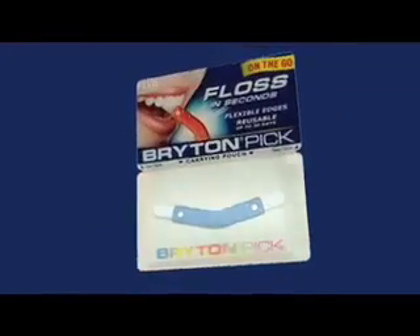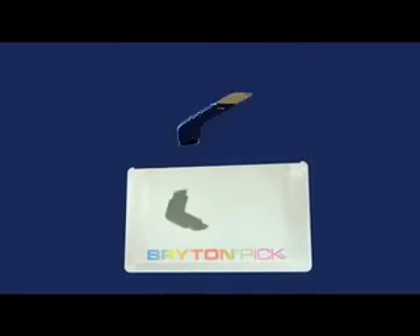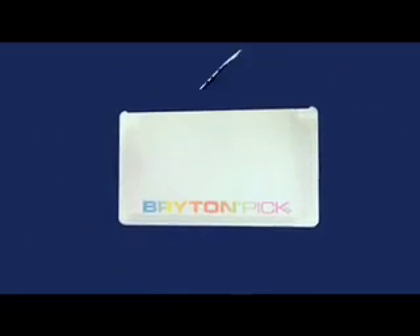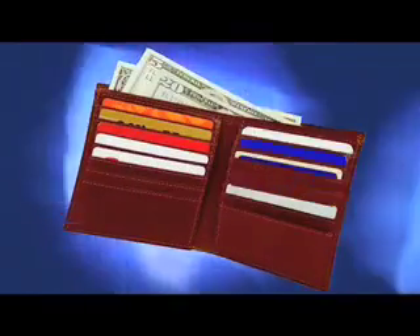The Bryton Pick cleaning edges are as thin as dental floss and very flexible. It's made from stainless steel, making it naturally germ resistant and reusable. Stored in its credit card size carrying pouch, it can be kept in your wallet for use after every meal.